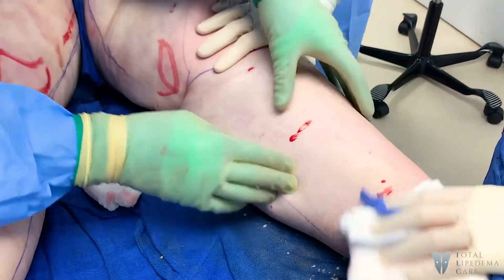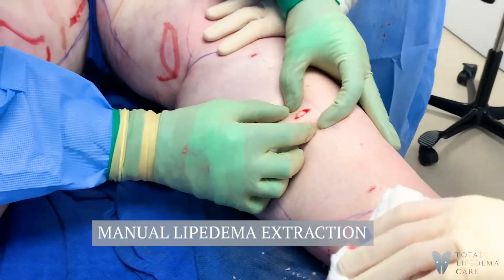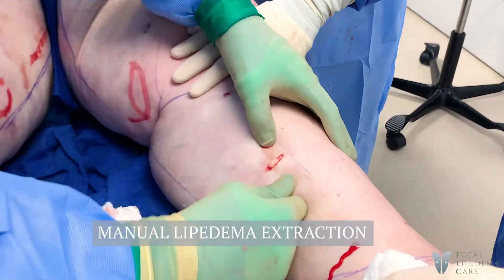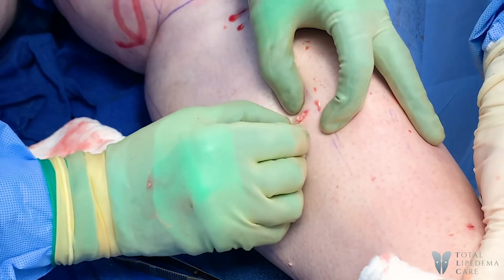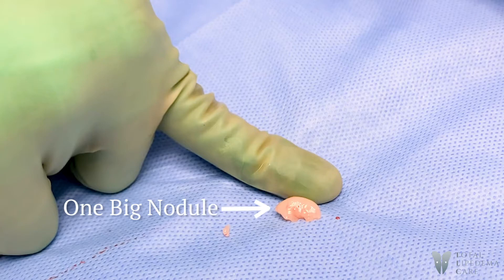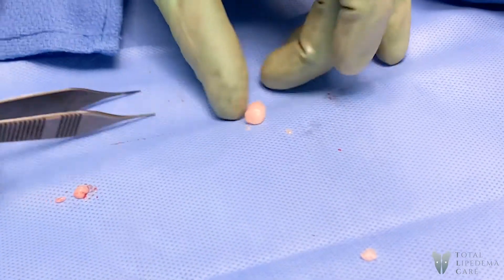However, you can start feeling these nodules now — these are really large nodules. As we made our incision for the manual extraction, look at that, right there is one of them. I want to show everybody — we'll slowly try to get it out. It's actually really still firmly in there. We'll detach it. Look at that — and just to show you how big that is, that's my finger. Look how solid this is right here. This is the stuff you've got to get out manually.